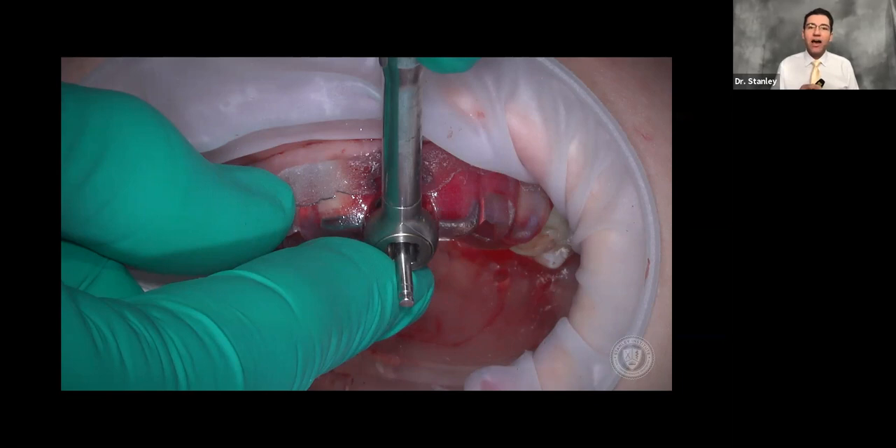Once we've accomplished proper depth, we want to make sure we have our timing right. For those who don't understand what timing refers to: inside the implant is a hex — six sides — and we want one of those flat hex sides facing out towards the facial. As you can see, the wrench is already pretty much aligned; we got lucky in this case and it stopped with the flat near the facial. If it was off, I would use the hand wrench to turn the driver until the flat was lined up with the facial. The reason that's important is that for prosthodontic solutions using off-angled access components, the hex has to line up — so keeping the flat to the facial gives you more freedom with your prosthodontic solutions.